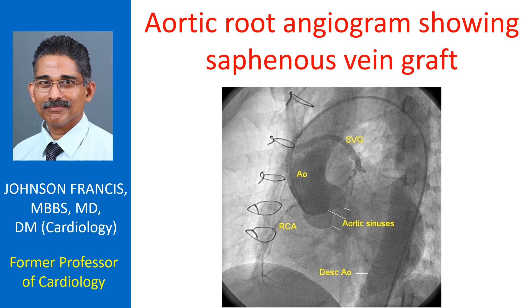The right coronary artery is seen arising from the right sinus and has a tight proximal lesion. Distally, the RCA is totally occluded beyond the right ventricular branches, but that is not clear in this image — it had already been delineated in a selective right coronary angiogram.